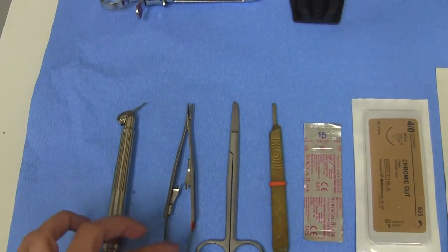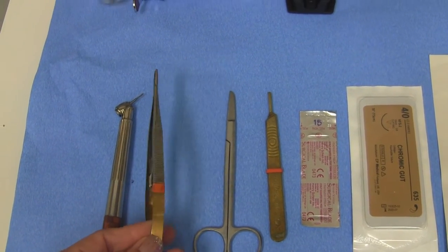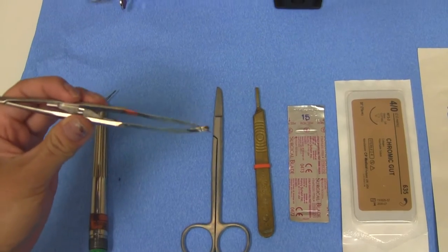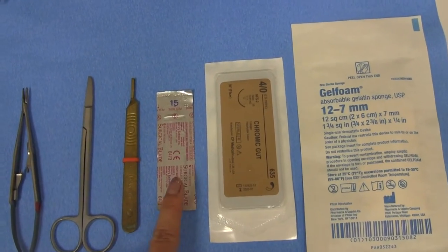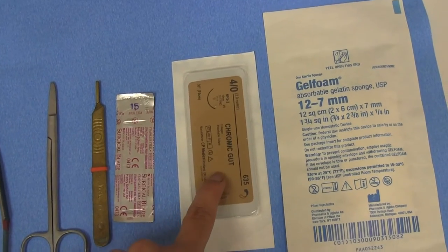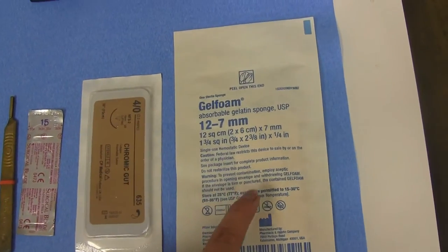You will also want the gold hemostats, also called the castros — these are really flexible, as you can see. You want a pair of scissors, some Bard-Parkers, the 15 blade, some chromic gut dissolvable sutures, and also the Gelfoam.